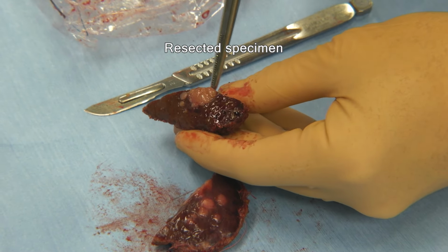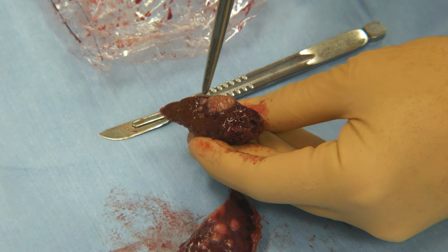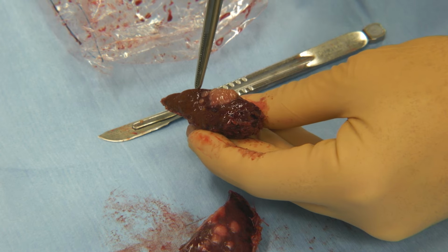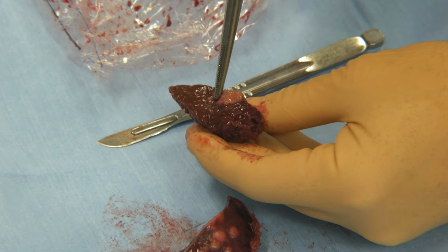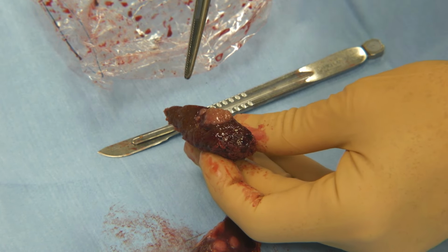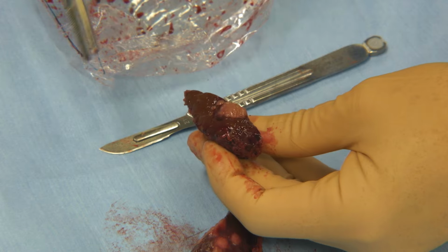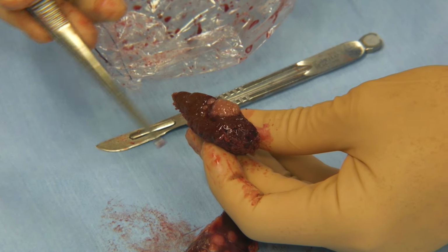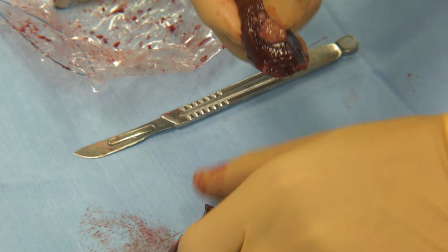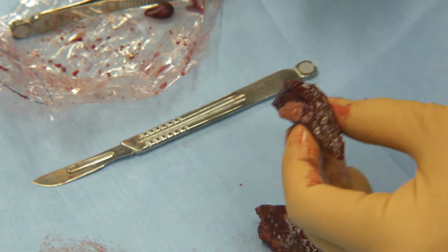consistent with hepatocellular carcinoma, and indeed may be intrahepatic metastasis. Okay, the main tumor and the daughter nodules surrounding the main tumor, but the surgical margin is negative for cancer, and the margin will be more than 5 millimeters. So that's why we could not detect fluorescent signals from the raw surface of the liver. Then let's see the fluorescence imaging on the resected specimen.